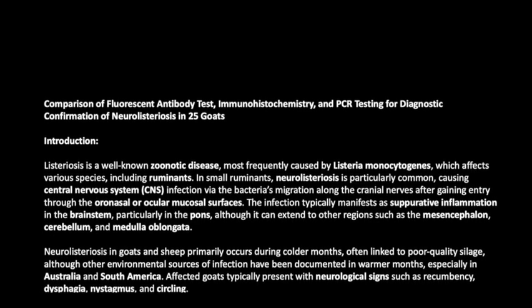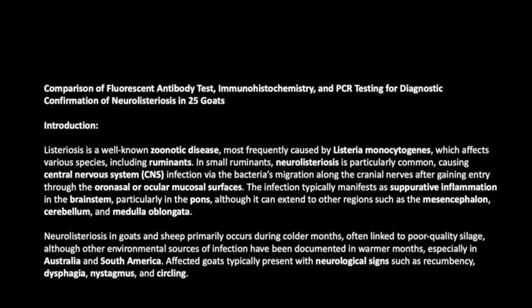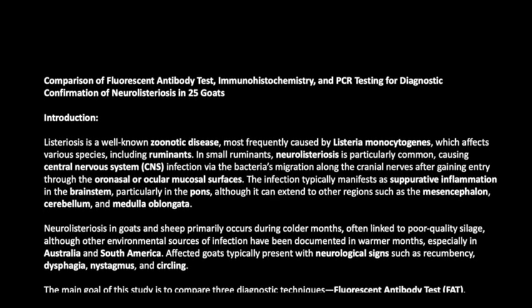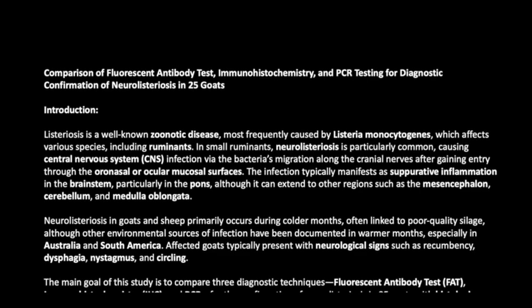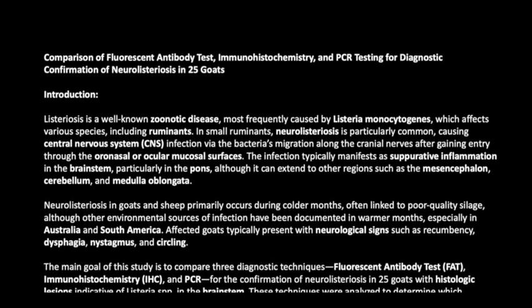Comparison of fluorescent antibody test, immunohistochemistry, and PCR testing for diagnostic confirmation of neurolisteriosis in 25 goats. Introduction. Listeriosis is a well-known zoonotic disease, most frequently caused by Listeria monocytogenes, which affects various species, including ruminants.